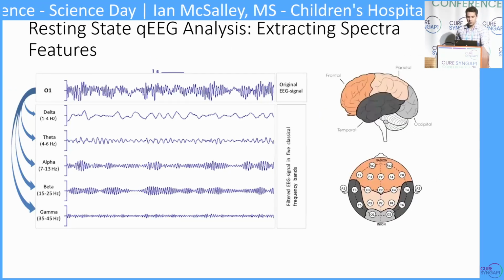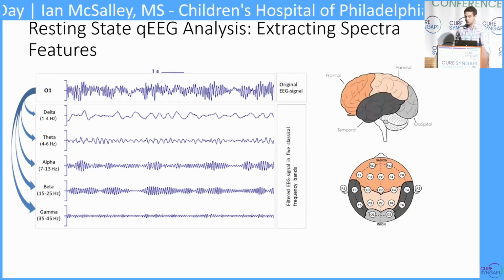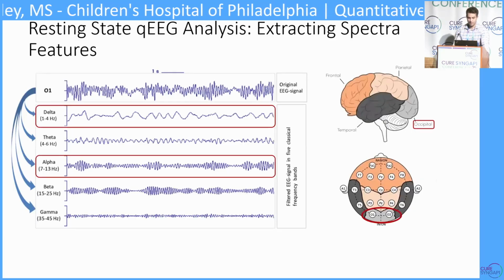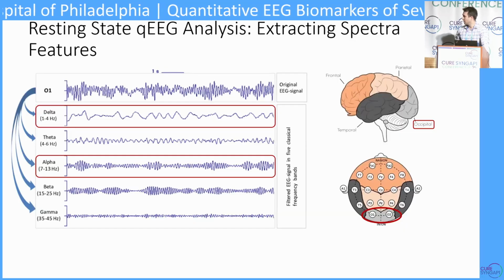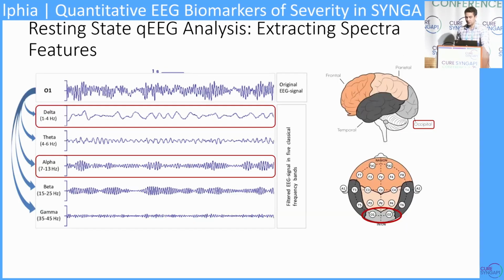And lastly, by considering the placement of the electrode on the scalp, we can group electrodes to get spatial contextualization for these power bands, or ratios that we measure. So for example, if we compare the alpha and delta power bands recorded from channels O1 and O2, seen here at the bottom of the screen, we would have the occipital alpha-delta ratio.